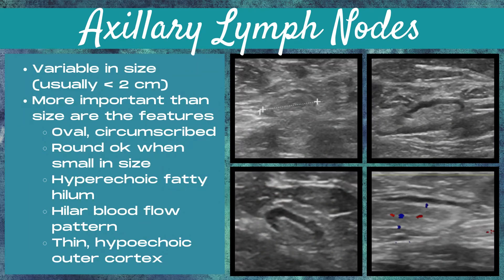The axillary lymph nodes are really variable in size, although they're usually less than two centimeters, but more importantly than their size are the features. Like other lymph nodes, we want them to be oval and circumscribed — it's okay if they're round when they're small. We want to see a nice bright hyperechoic fatty hilum, a hilar blood flow pattern, and a thin hypoechoic outer cortex.